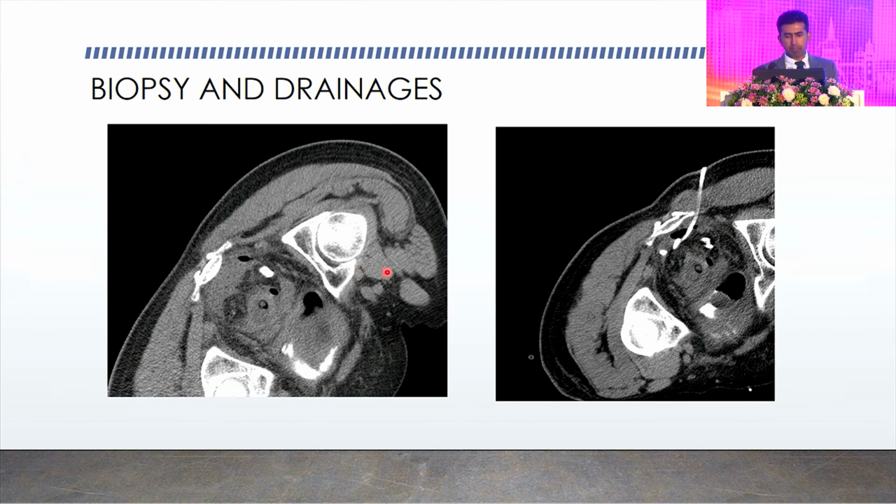Biopsies and drainages. Just to complete my presentation, certain collections such as presacral or deeply seated pelvic abscesses can be drained under CT guidance. In this patient, the approach is transgluteal. Over a wire, a pigtail can be placed without damaging the adjacent structures.